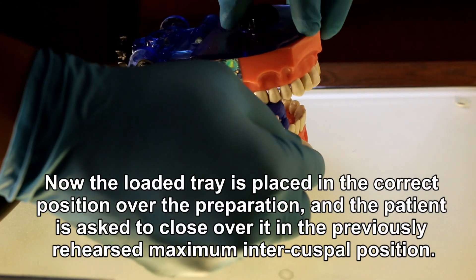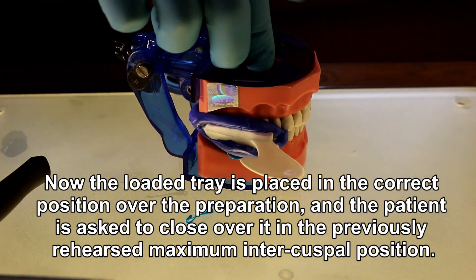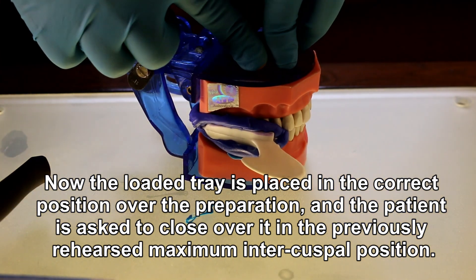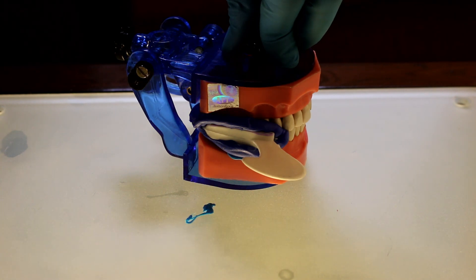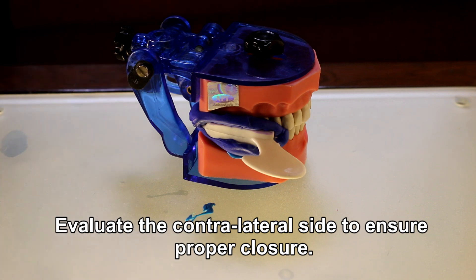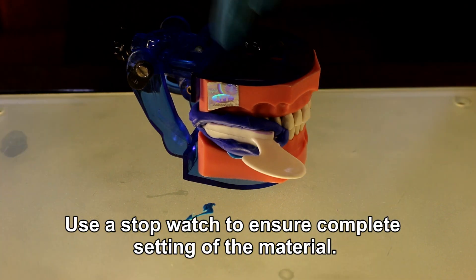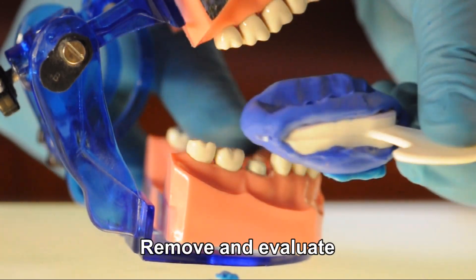The loaded tray is placed in the correct position over the preparation and the patient is asked to close over it in the previously rehearsed maximum intercuspal position. Evaluate the contralateral side to ensure proper closure. Use a stopwatch to ensure complete setting of the material, then remove and evaluate.